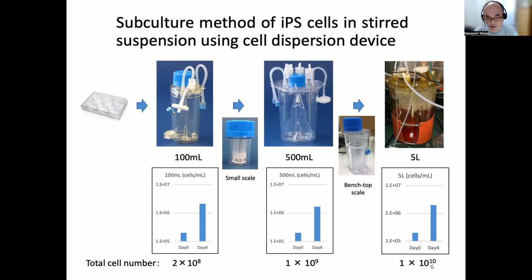For cell dispersion, no enzyme solution was used in all steps, and PBS containing only EDTA was used. The obtained cell suspension was not centrifuged, and the dispersed cell suspension was directly inoculated into the culture medium.